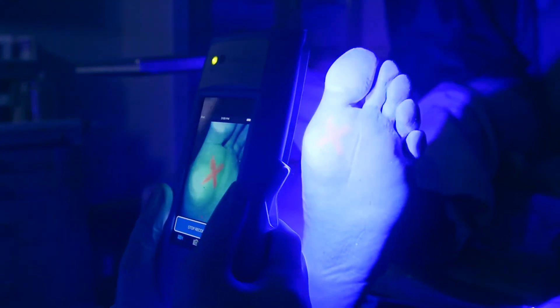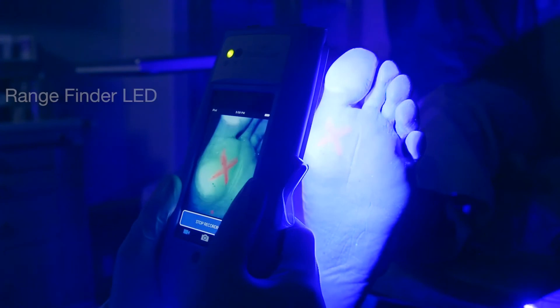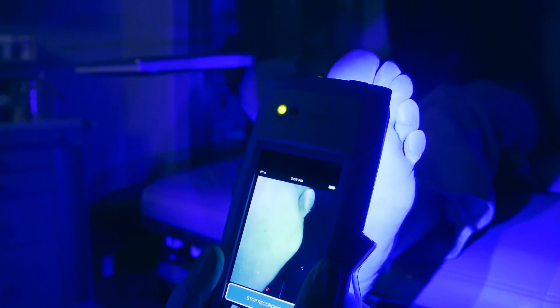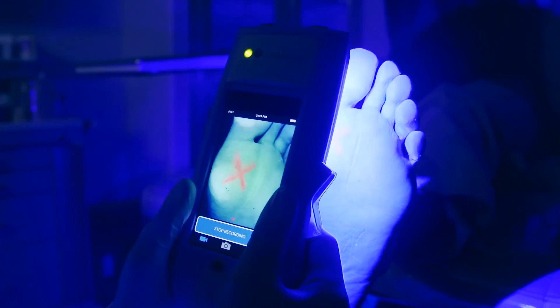As you move the device around the target, maintain a steady distance so the rangefinder LED is always green. Also note that the LED will automatically time out after 90 seconds. If this happens, simply toggle the rocker switch up and back down to continue imaging.